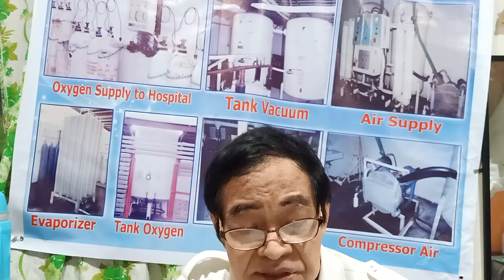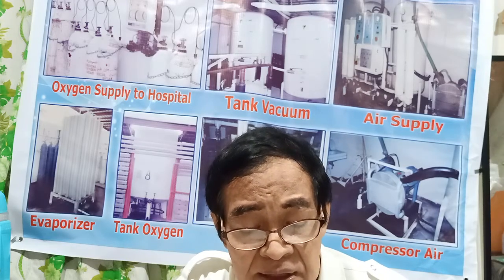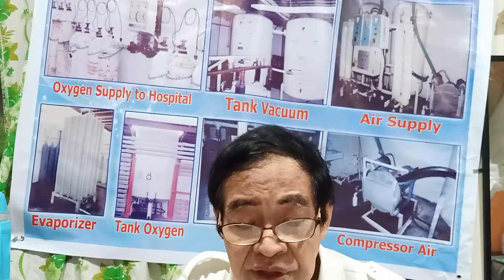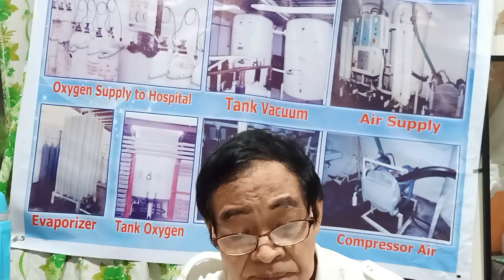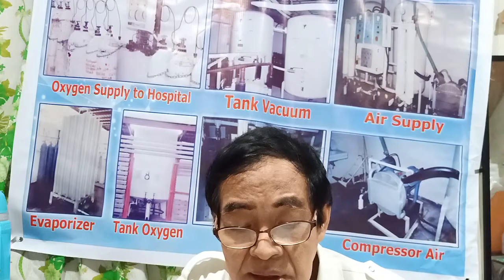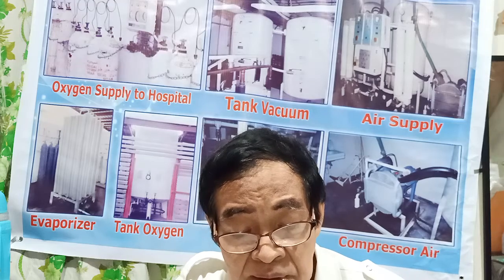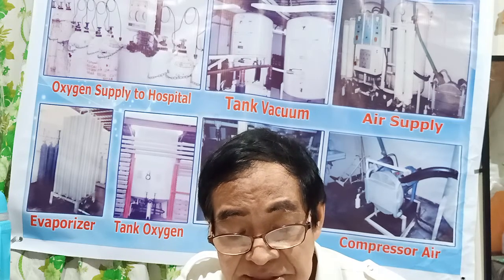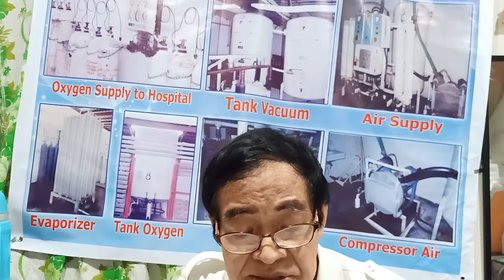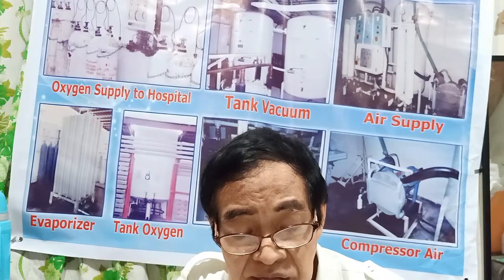Increased nitrogen in the air contents does not affect the respiratory system, which means that unconsciousness as asphyxiation occurs without warning. The lower the oxygen content of the air being breathed, the quicker asphyxiation occurs. Then, after discharge of gas into a closed space, it is extremely important to effectively flush the area of the air and measure the oxygen content before personnel enter the area.